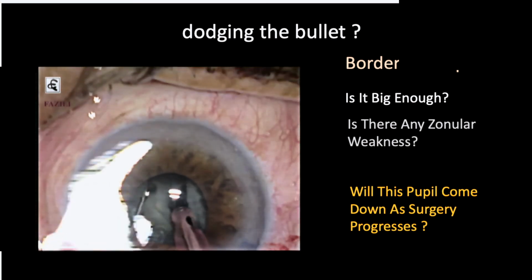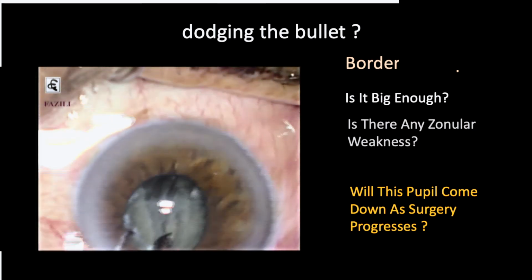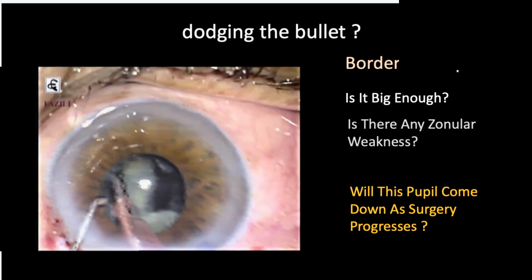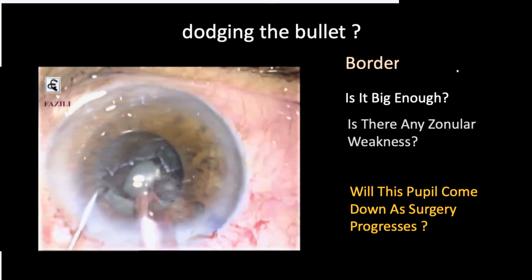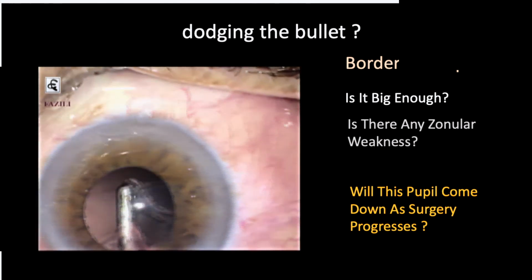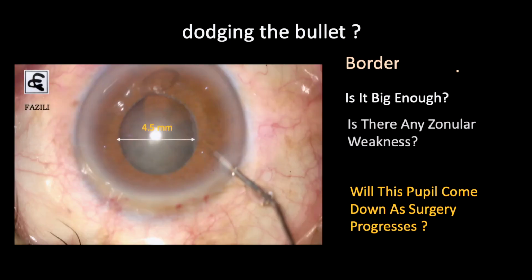Sometimes you can move the capsular flap over the iris, but not touch the iris. Because if you touch the iris, this already plus-minus pupil is going to quickly become smaller, and the pupil size will become difficult, and then there's a difficulty in surgery. You can see in the surgery that the pupil size more or less has remained the same during surgery, and we have been able to go through it without any issues. Then there's this other pupil. It's almost the same size, but you can see more pseudoexfoliation.